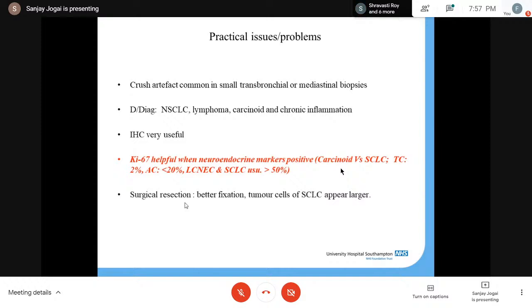So a good idea there is to give a summary, and the way I express it is, as a bottom line I would say high-grade neuroendocrine carcinoma, but within the free text describe that there are areas within this tumor which look like small cell. However, in other areas there are features of large cell neuroendocrine carcinoma. Invariably the clinicians would be treating these cases as small cell. But as a pathologist, we are most appropriate when we can express that dilemma.